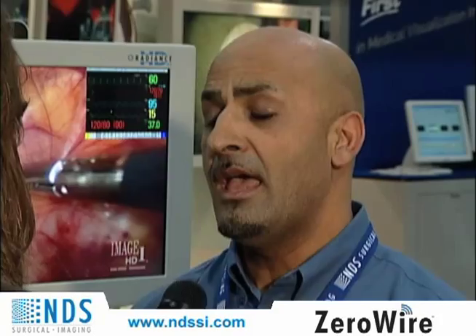Some people may have the misconception that implementing a wireless solution is more expensive, but of course the opposite is true. If we think about the combination of equipment plus labor, with ZeroWire the cost of the equipment is a little bit higher, but labor is much lower because with the push of a button you get equipment connectivity. ZeroWire provides you with a system that's lower cost and better performance.